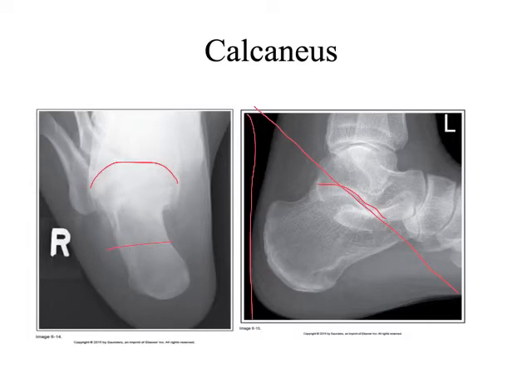So lateral, medial to lateral. So we're projecting from the medial aspect of the foot to the lateral aspect, right? So we kind of have the patient frog-legged or laying on their right side, for instance, or their left side if I'm doing a left one, right? And the central ray is entering on the medial aspect and exiting on the lateral aspect. So that would be the projection, right? We want to see those talar domes, and then the tibiotalar joint space open, right? So I can kind of evaluate that joint space there.